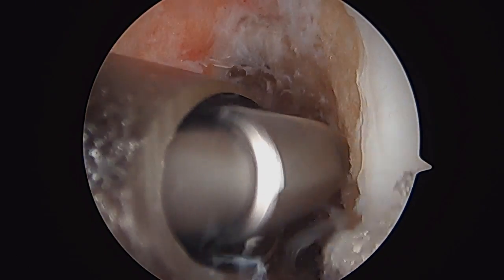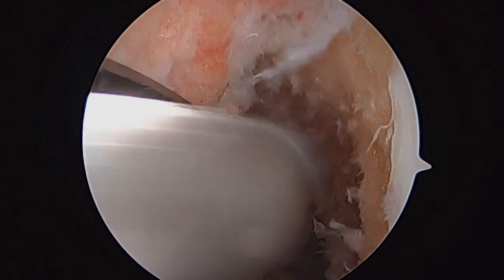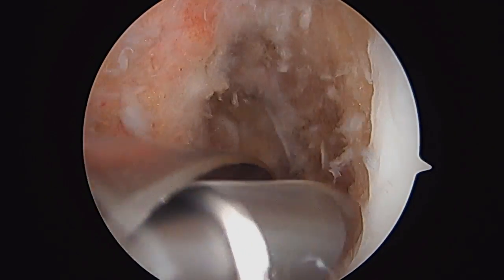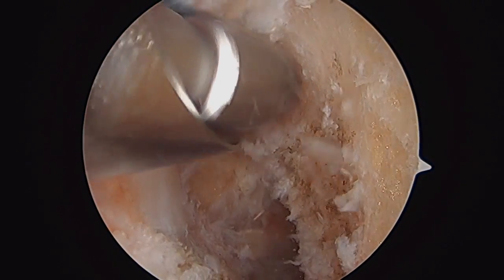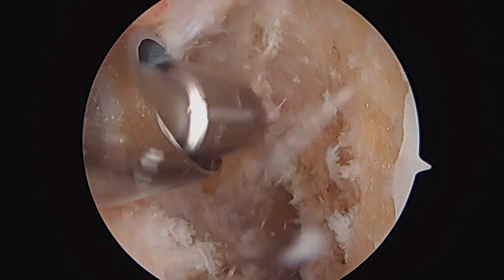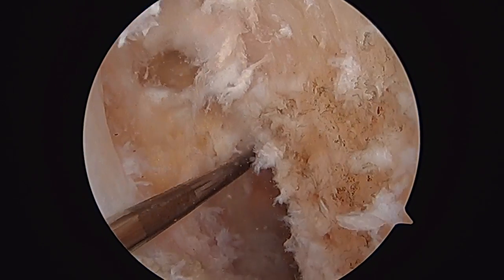I used debridement of the ACL stump and a minimal notchplasty, really just to allow visualization. If the ligament is placed in the anatomic position, the notchplasty is not that important, but one needs to be able to see landmarks and see the back wall for this procedure.